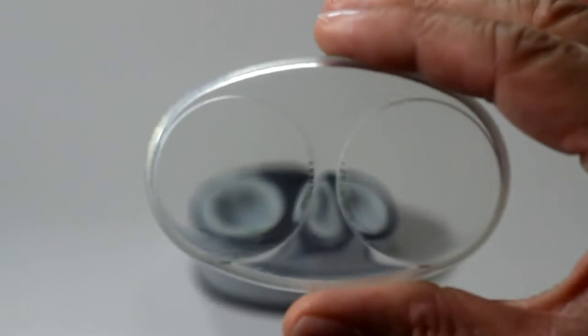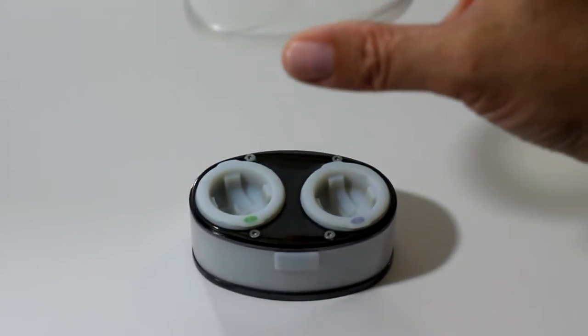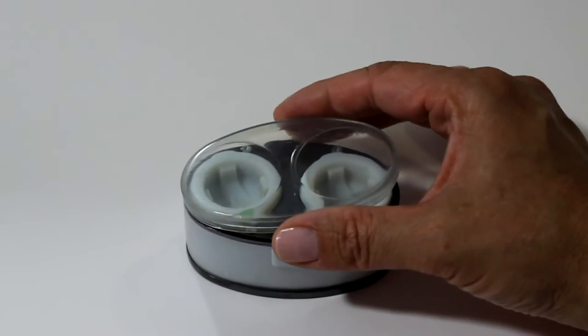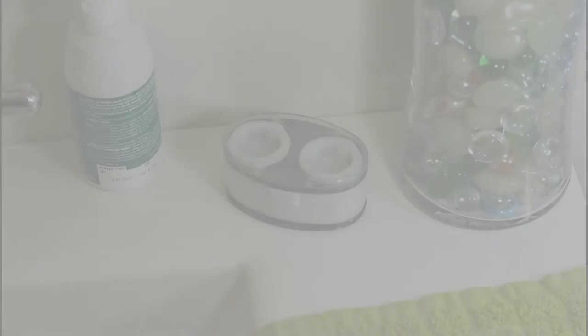Because of the risks unclean contact lenses carry, Swoosh was born — the first ever contact lens case that supercharges the contact lens solution, helping clean and disinfect your contact lenses.